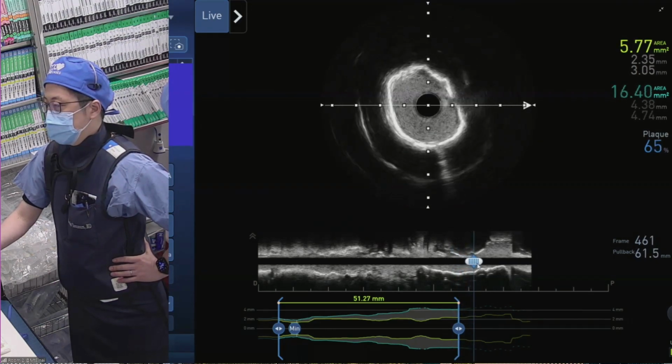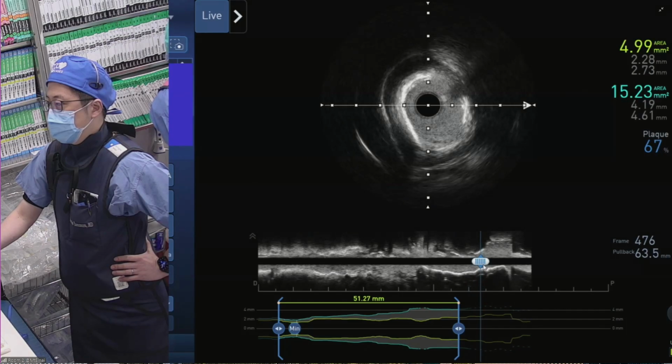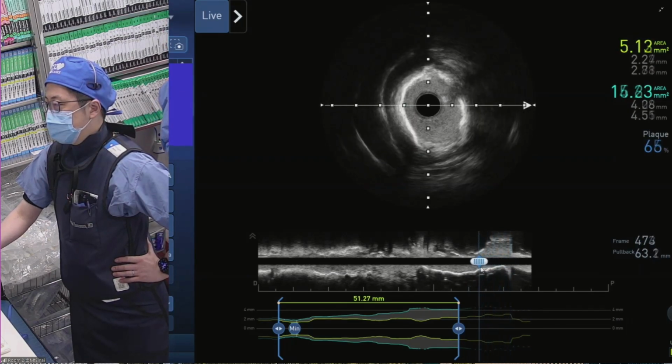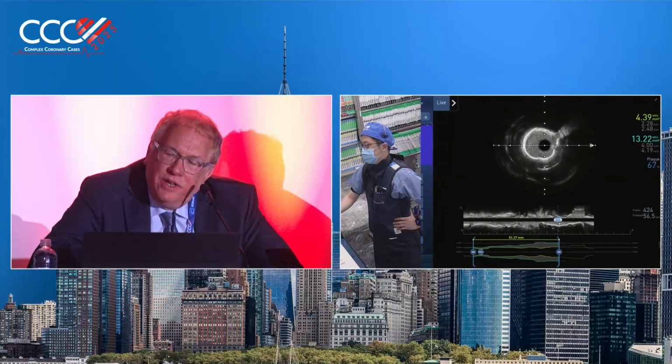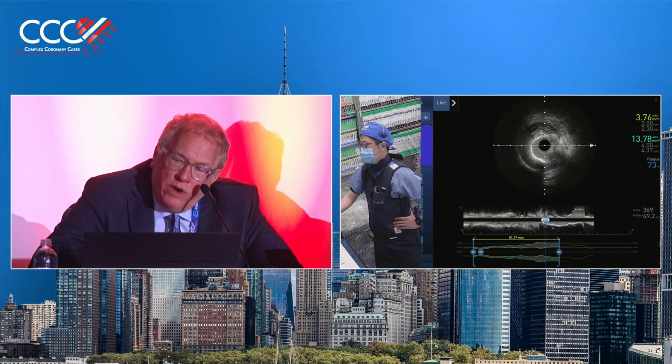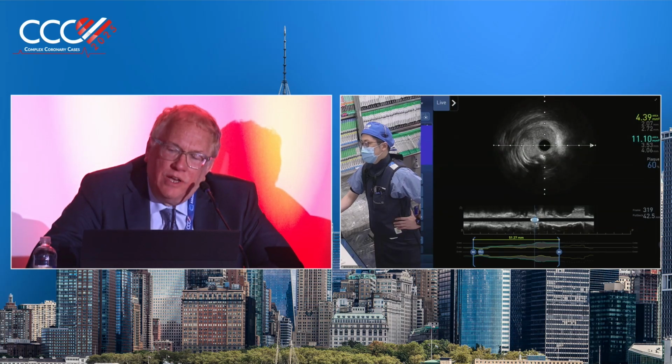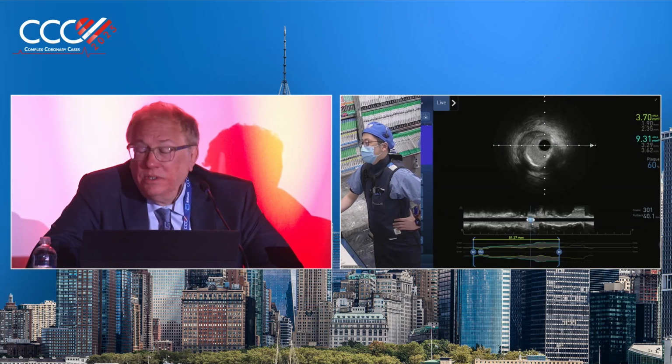Yeah, I would use a larger balloon. I don't think you need another, it's not that long a lesion. I think the vessel's large, you can go ahead. And I think you do have one fracture in most of the places. So I would just use a larger balloon.